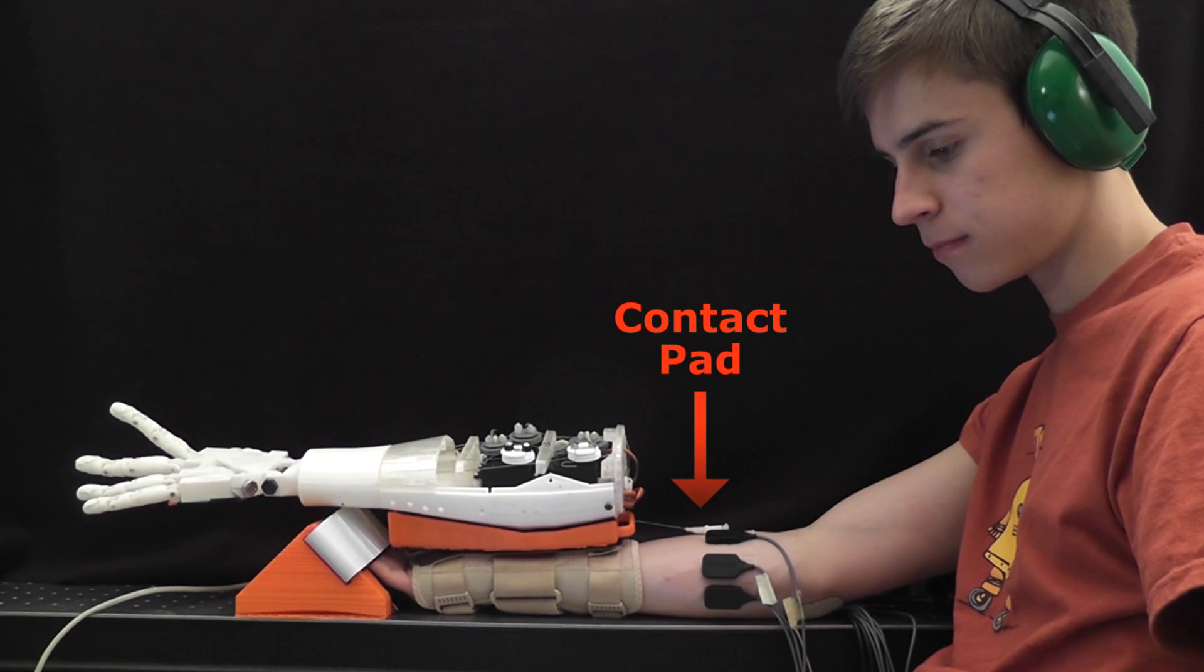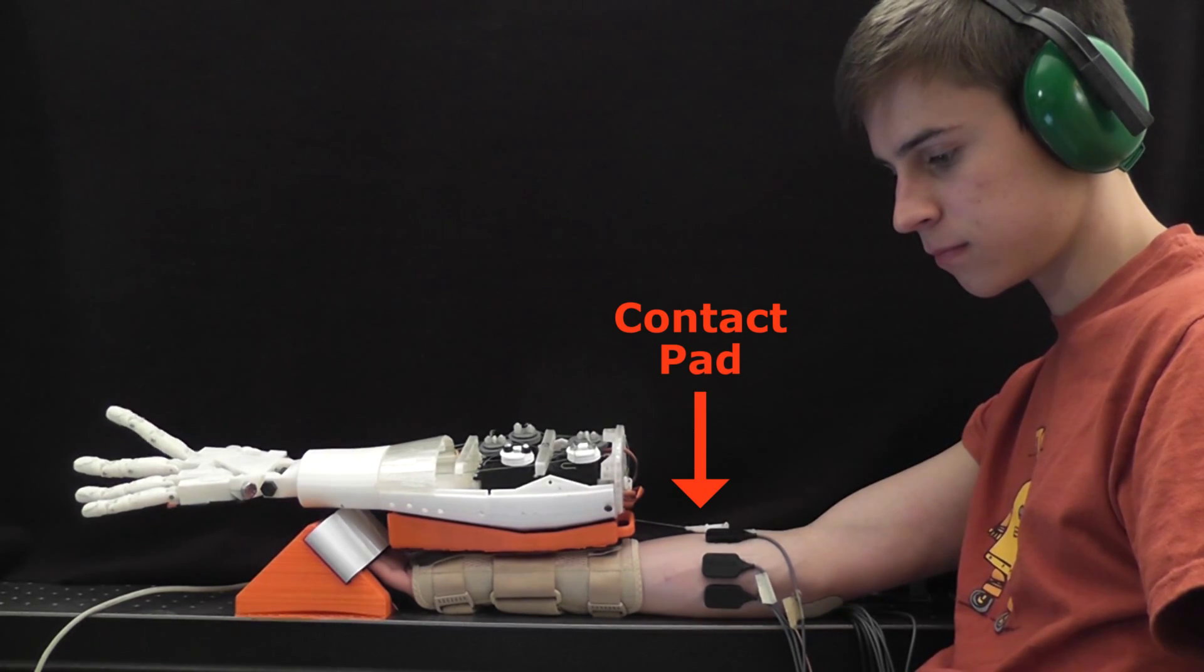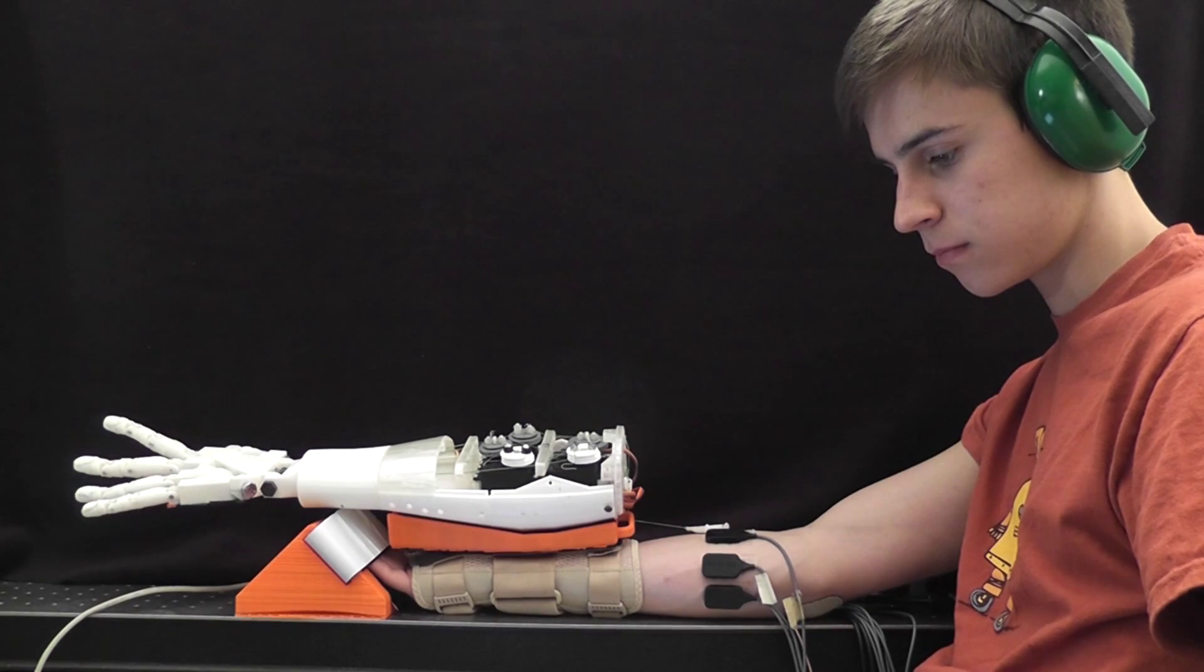When a finger moves, a contact pad is displaced by a proportional amount and the subject correlates the amount of perceived skin stretch to the angle of the finger.